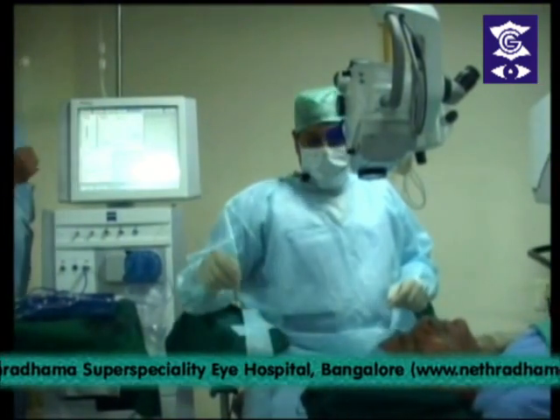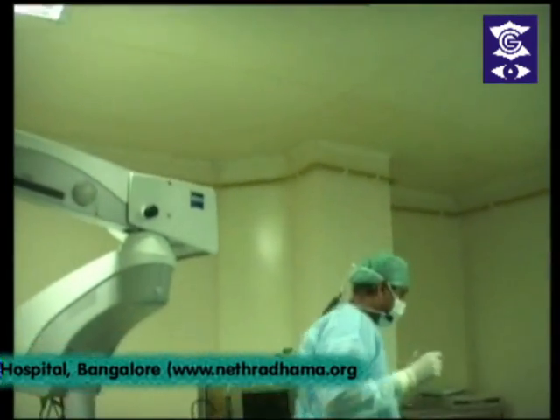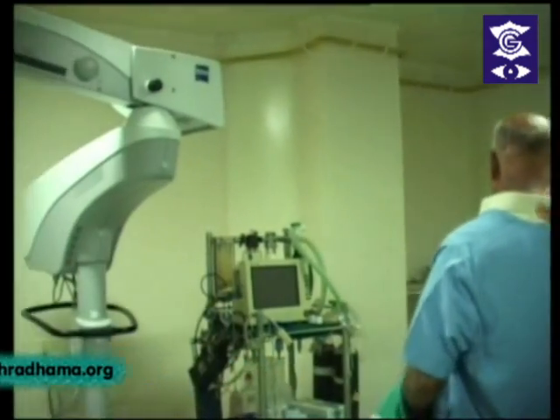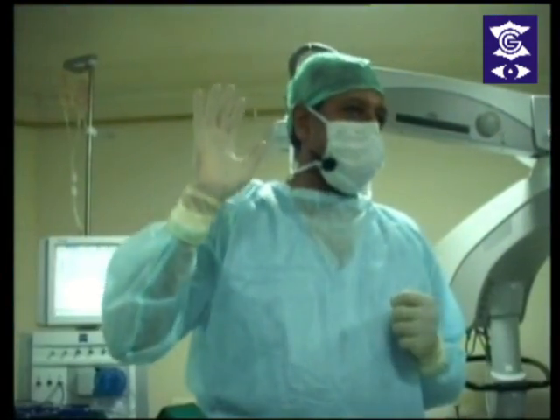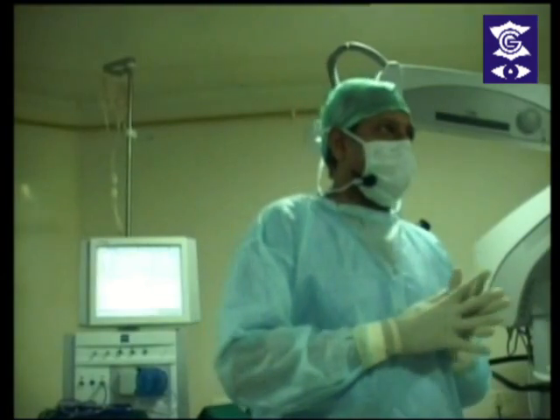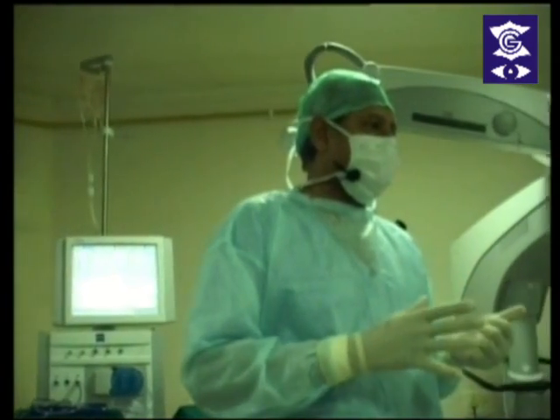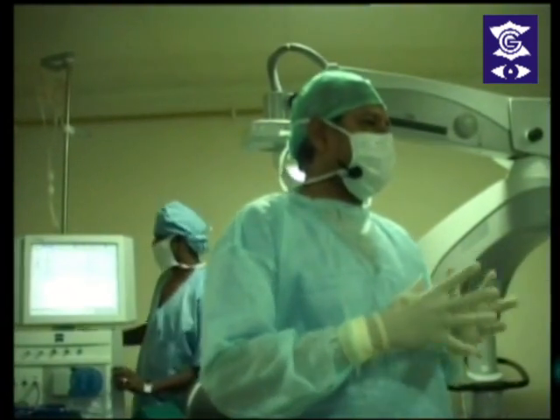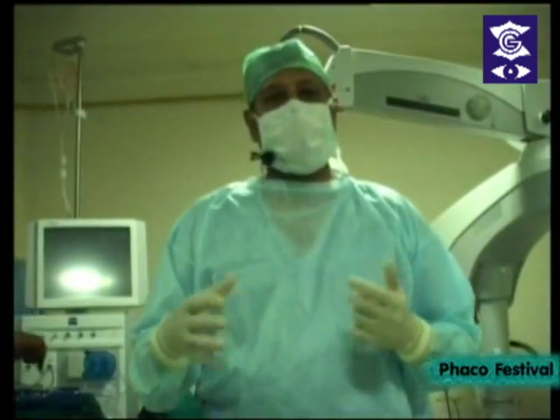For the beginner phaco surgeon, isn't it a better idea to divide the nucleus into as many fragments as you want and then eat them? One thing I'll advise even a beginning surgeon: if you're doing a chop or a stop-and-chop, take out the first small piece — that will give the surgeon a lot of space in the bag. If you try to rotate a difficult nucleus and keep the whole lens in situ even after chopping, it can make rotation difficult. Taking out one sliver can make the whole surgery much easier. Take out the first sliver, then chop it up into small pieces and take them out one by one.